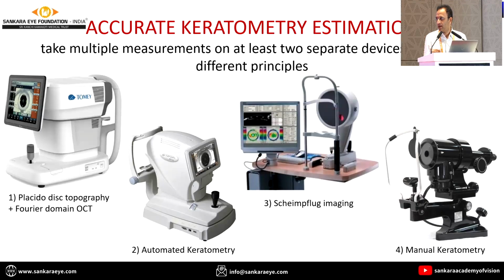These two are important. And invariably, we have all these equipments. In my experience, I always see a variation in each of these. So that is where you have to use your trial and error, your validation, your calibration, and ultimately your experience, and try to find out which is the best for you amongst the available resources.